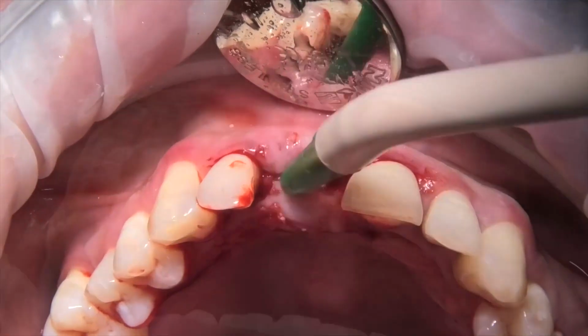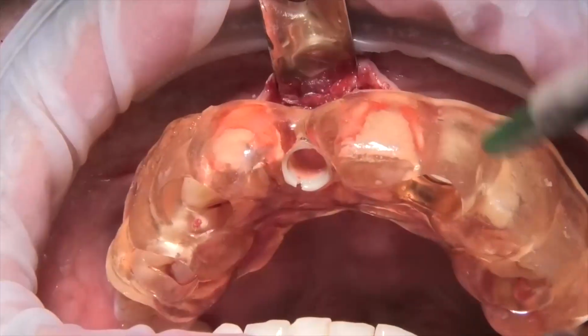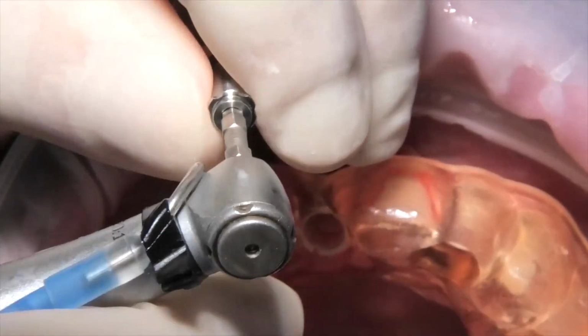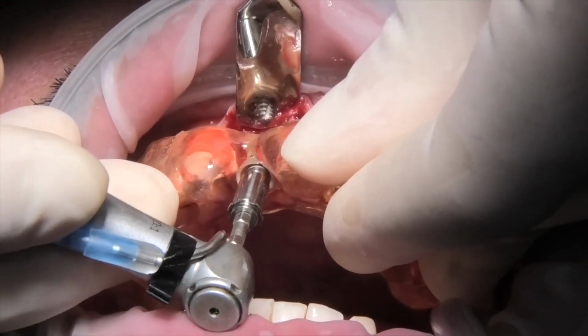with tooth-supported guides. Therefore, without fixing pins, keep the guide well locked with the fingers of the other hand, during the pass of the drill and during the placement of the implant, to avoid inaccuracy during the surgical phase. We are now ready to take the implant from its sterile blister with the carrier.